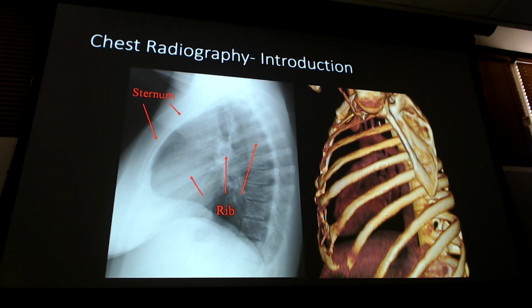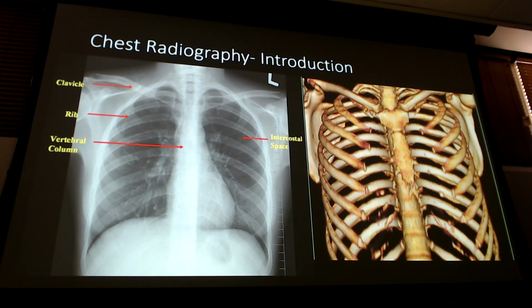So this is the side of each rib. If you wanted to know what part of the rib is fractured, if you see one here, you would go back to your AP or PA, try to find it in the general vicinity, look for your fracture, do your counting, and figure out it's the right rib, posterior number 5, or whatever it ends up being.